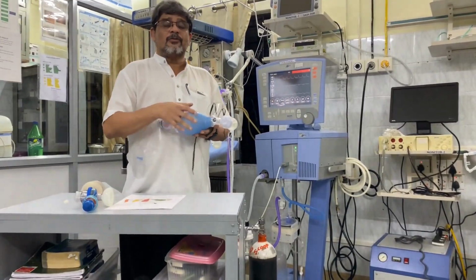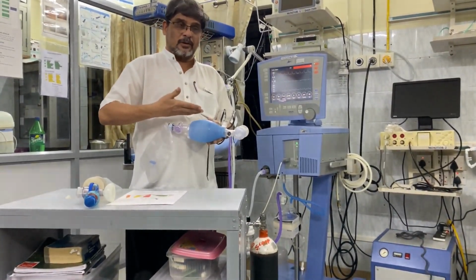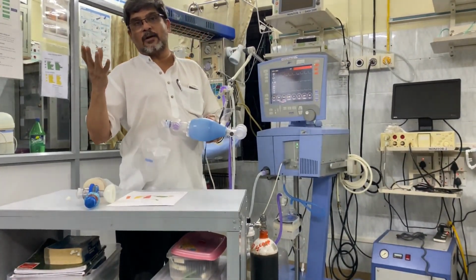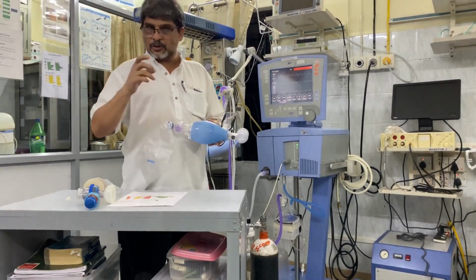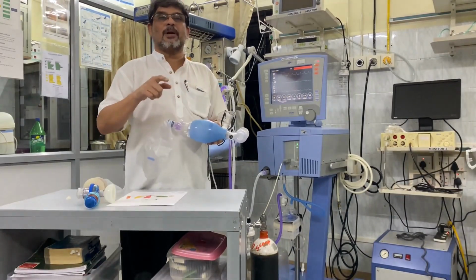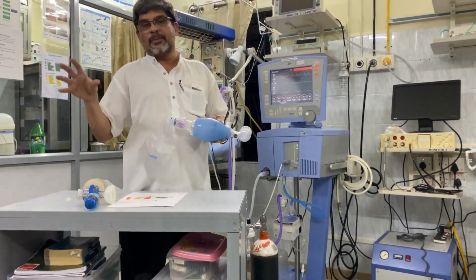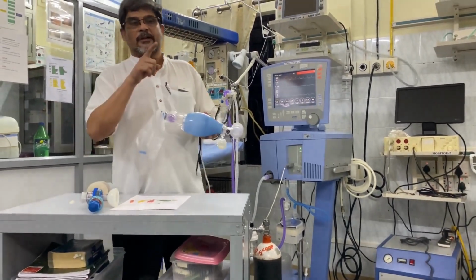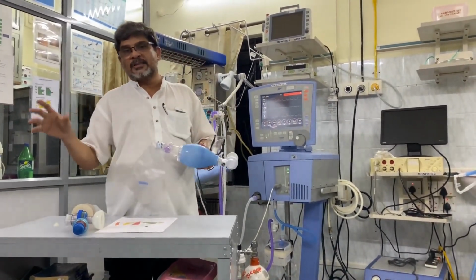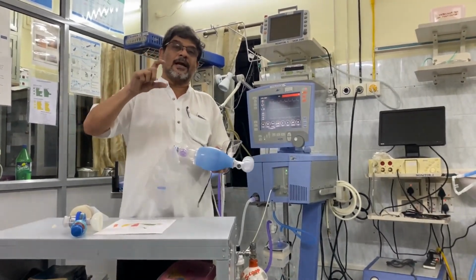So if you find that carbon dioxide is building up and ventilation is not occurring, not throwing out carbon dioxide, you have to increase the ventilation. You can do this by increasing the respiratory rate. So your minute volume increases, as minute volume is tidal volume multiplied by respiratory rate per minute. The volume that is exhaled out per minute is known as minute volume, and the volume exhaled per breath is known as tidal volume. So either you increase the minute volume by increasing the respiratory rate, or per breath you increase the tidal volume.